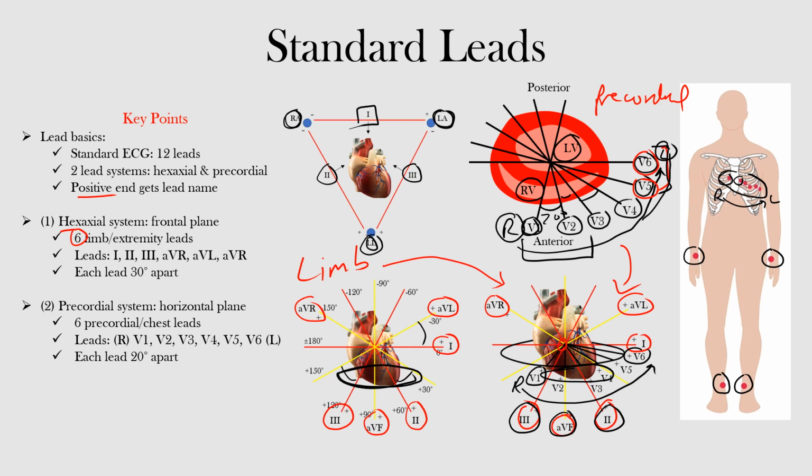What about leads V1 and V2? Well, these leads run along the septum, and therefore changes in these leads may indicate a septal wall MI. Okay, here's lead V1 and V2. We can see them better in these leads, and they're going right over the septum, and these are usually called the septal leads. So if you see any ST elevation in these leads, we may think of a septal MI.